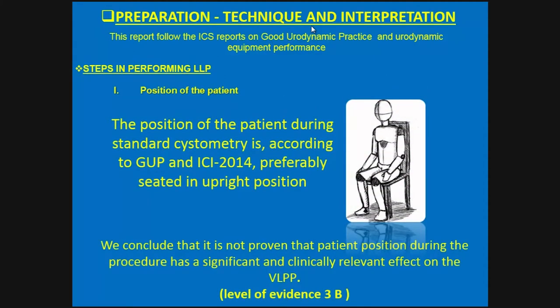So we go with preparation, technique, and interpretation. Regarding the position of the patient during the standard cystometry, according to good urodynamic practice, ICI 2014 confirms it is preferably seated in an upright position.